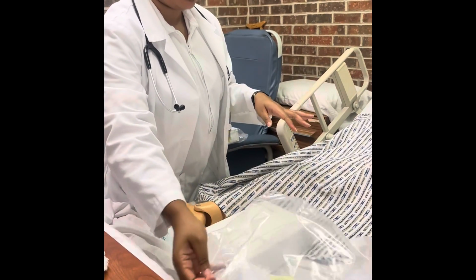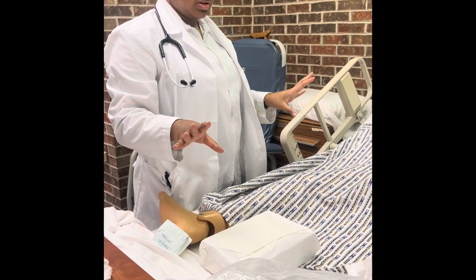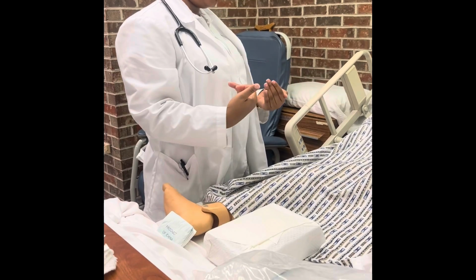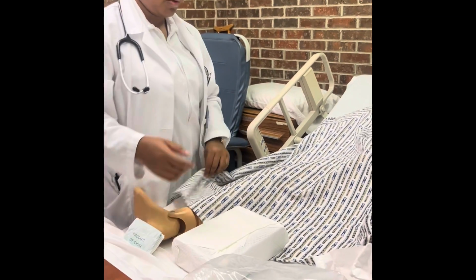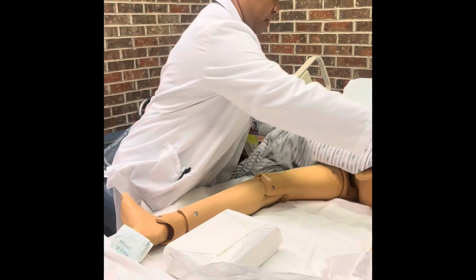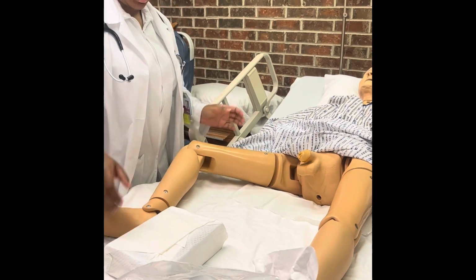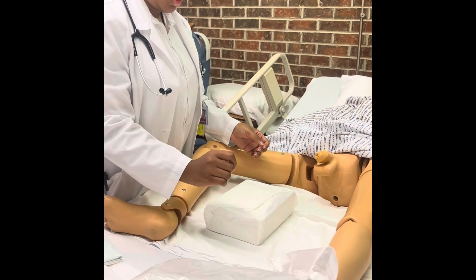All right. Oh, I did mean to say, before I open my foley kit, because it is a sterile kit, I would get the bed to the highest position, best working position for myself, and get you in a position that is comfortable for you and comfortable for me to work with. So I'm going to pull up your gown because I have the exposure, okay? And I need you to flex your knees as best you can so I have a good view of your private area. Okay, now I'm going to open my kit.